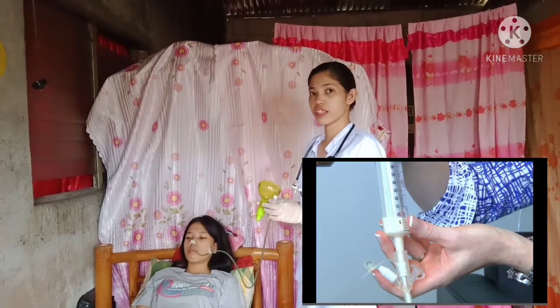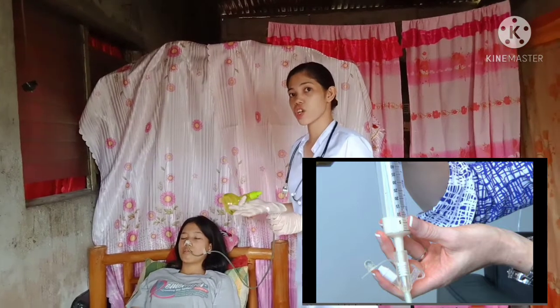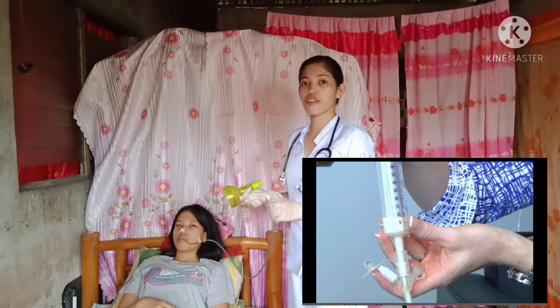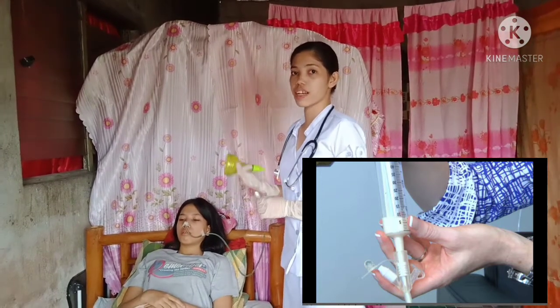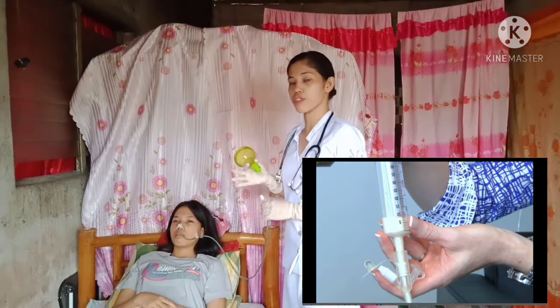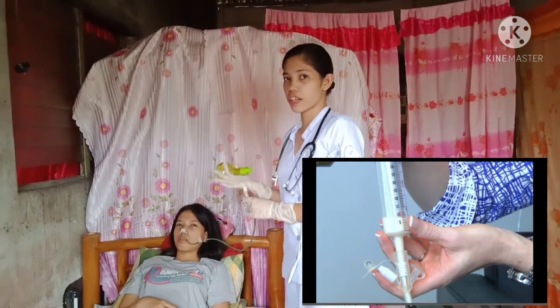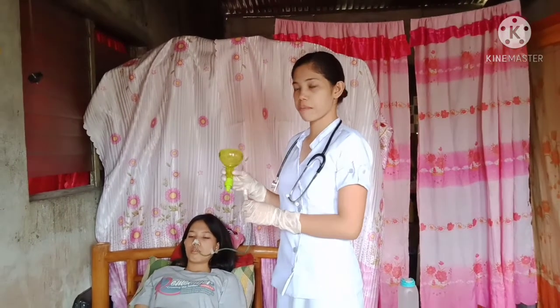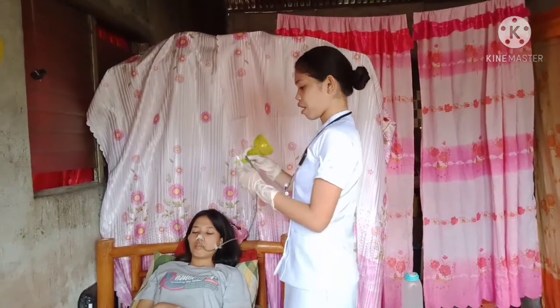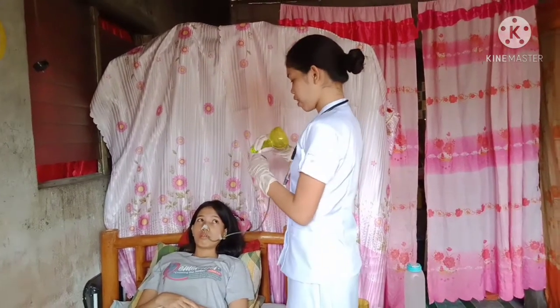So after that, we have to prepare the feeding tube container to administer formula and have this at room temperature, since cold formula may cause gastric cramping and discomfort because liquid is not warmed by the mouth and the esophagus. You have to connect tubing as needed or prepare a ready-to-hang container. And the tubing must be free from contamination to prevent bacterial growth. So we have to clamp this to prevent air from entering the stomach.